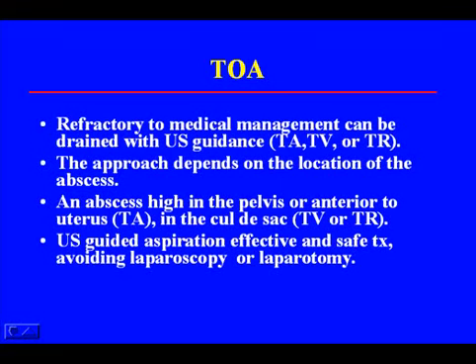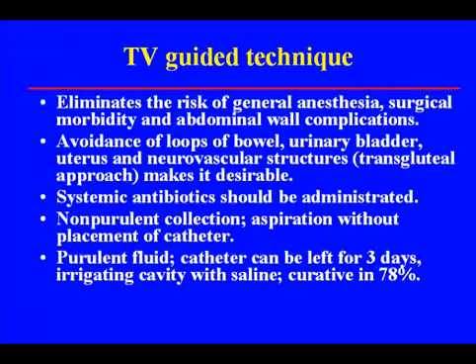Ultrasound-guided aspiration is very effective and safe and avoids laparoscopy and laparotomy. The transvaginal guided technique eliminates the risk of general anesthesia, surgical morbidity, and abdominal wall complications. It also avoids the loops of bowel, urinary bladder, uterus, and neurovascular structures, therefore making this procedure much more desirable.